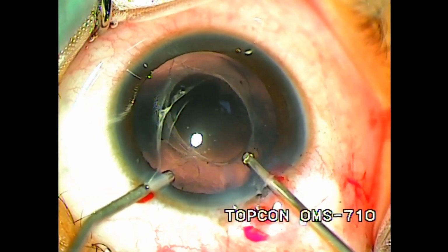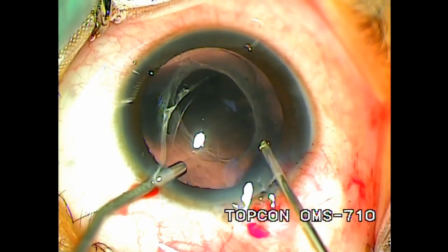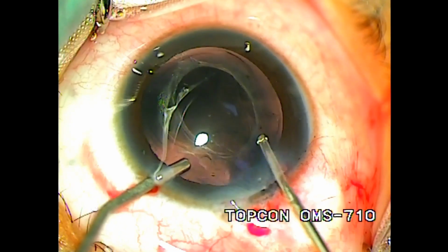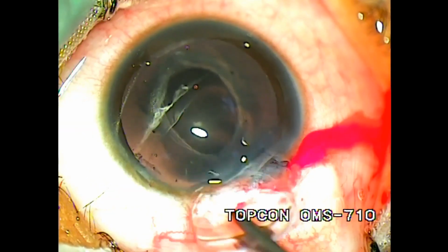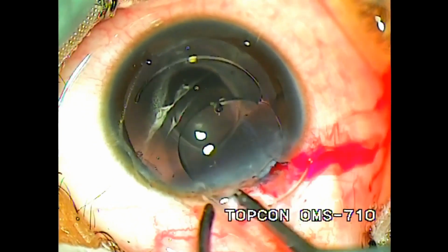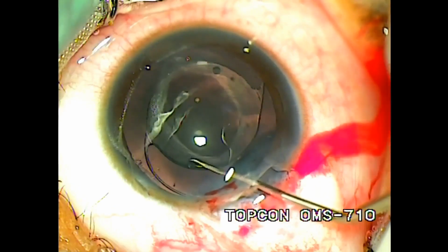When performing infantile cataract surgery without primary intraocular lens implantation, leave an adequate capsular rim for subsequent IOL implantation. A 4.5 mm central posterior and anterior capsulotomy is usually adequate to prevent opacification of the visual axis, but assures an adequate rim of support when secondary IOL implantation is elected.